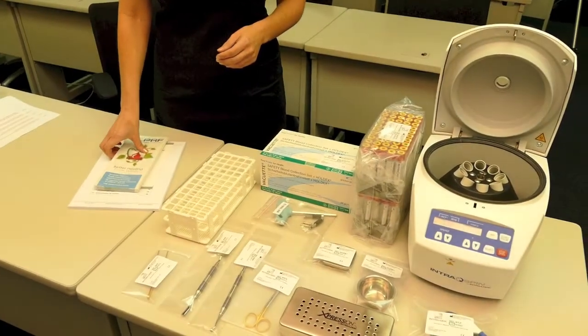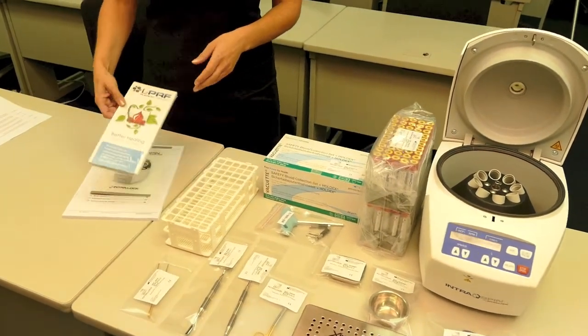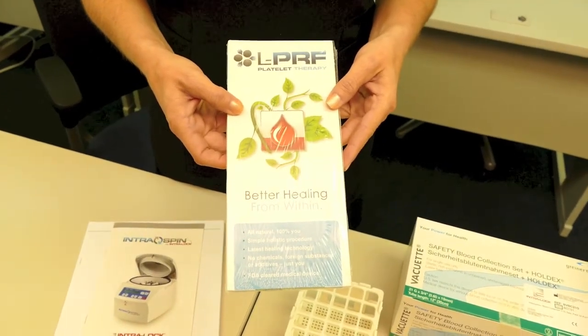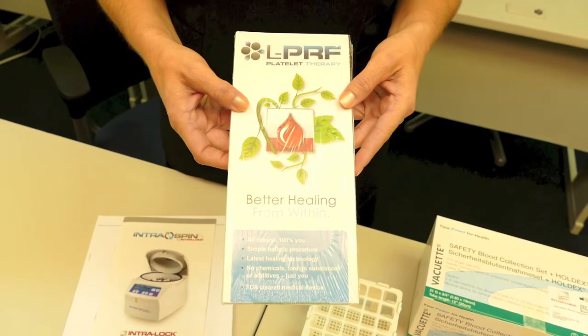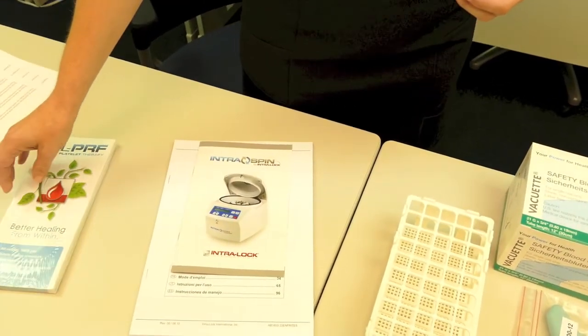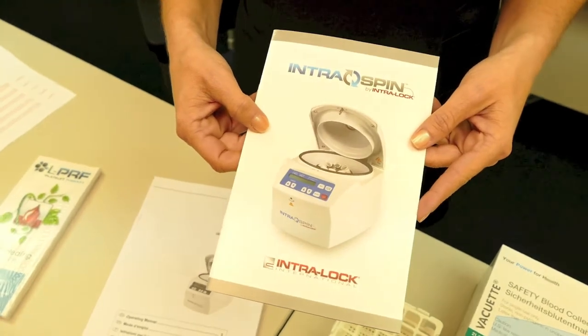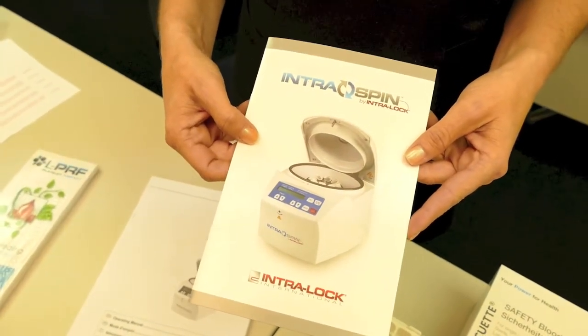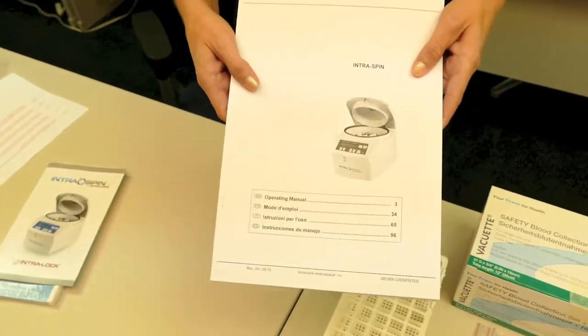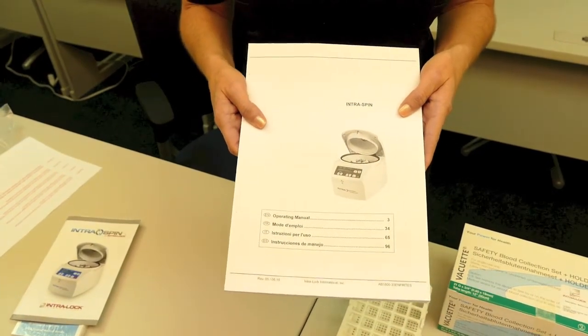To conclude our basic installation of the IntraSpin system, let's review a couple of things. You have your patient education brochures. This is a great tool for educating the patient on the benefits of LPRF platelet therapy. Those are available for reorder with Intraloc. You have your FDA cleared protocol manual. Please follow this precisely. And again, your operating manual. This is beginning to end everything you need to know about using the IntraSpin system.